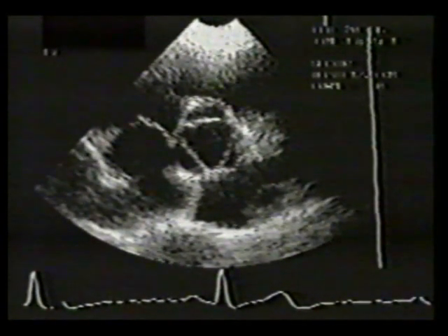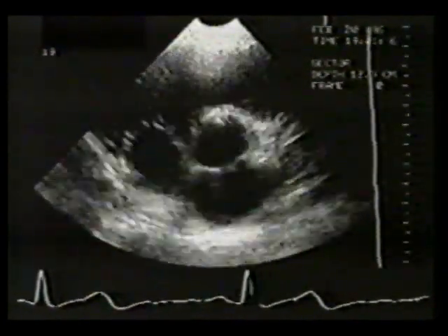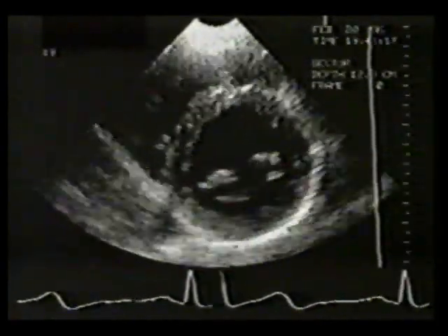We have now completed the short axis examination of the heart from the left parasternal position. Review the short axis anatomy as the heart is scanned in real time from the aortic valve level to the level of the papillary muscles. Using a computer with a frame grabber, we will now display 4 different tomographic sections simultaneously: parasternal long axis and short axis at midventricular level, mitral valve level, and aortic valve level.